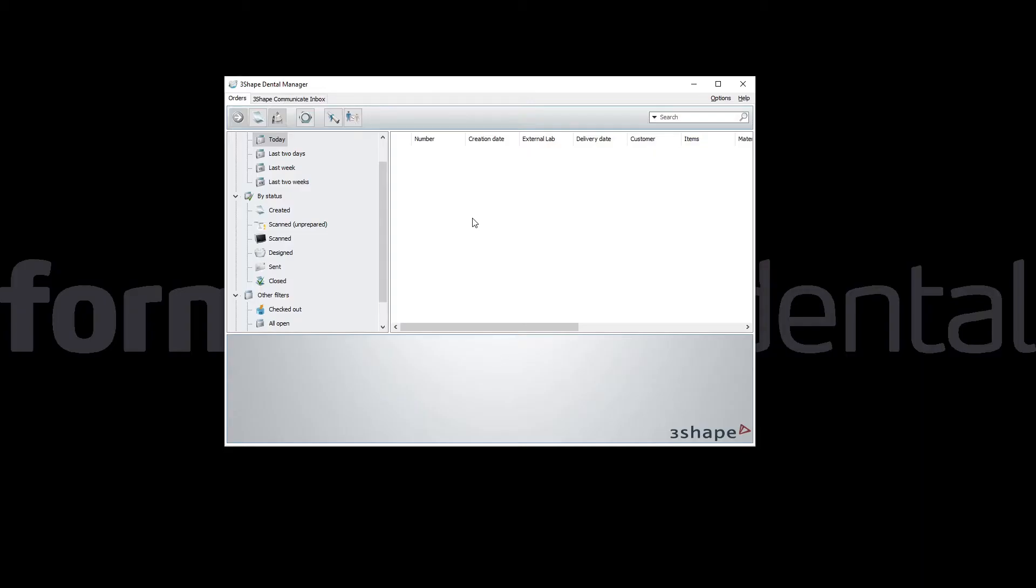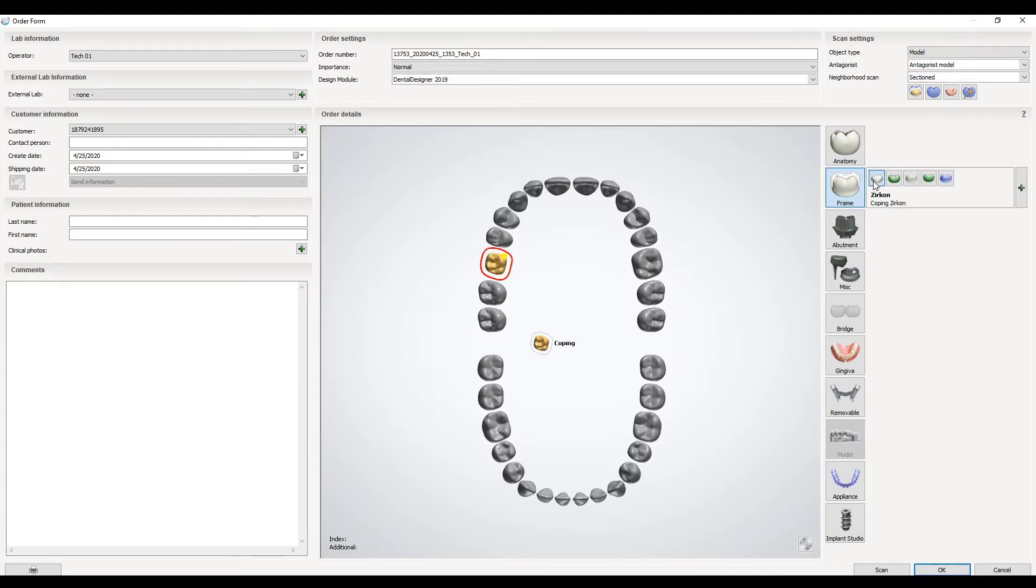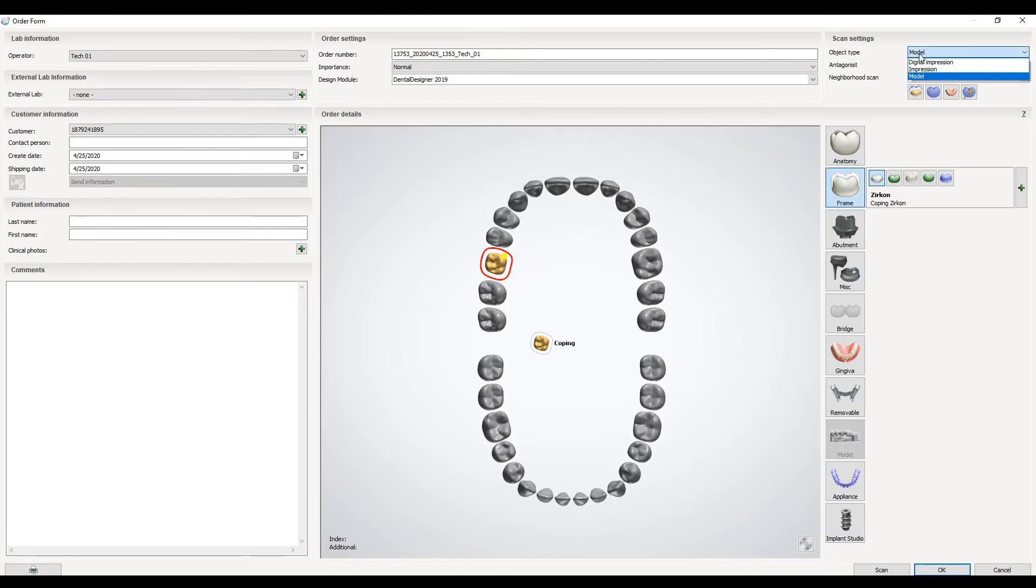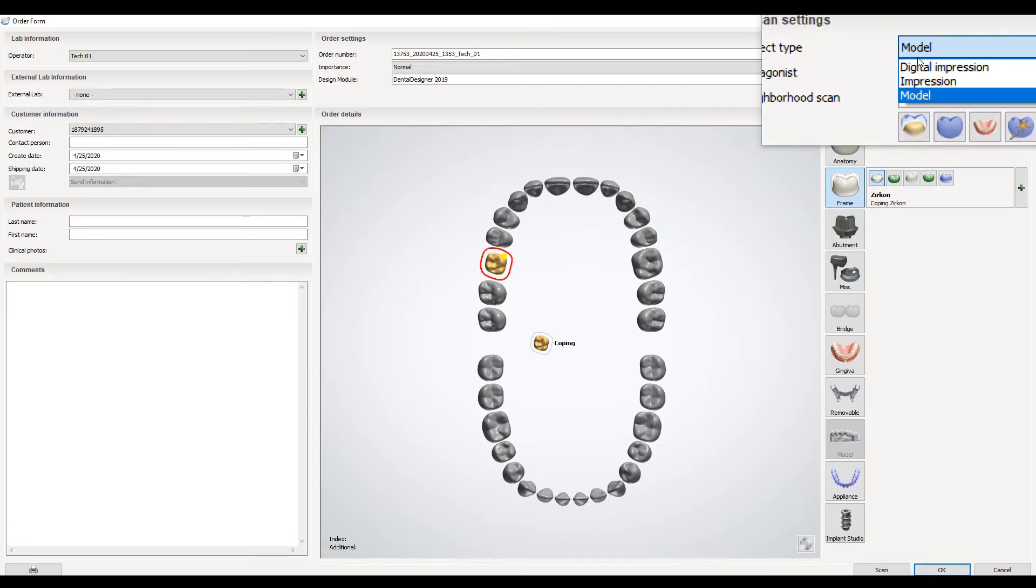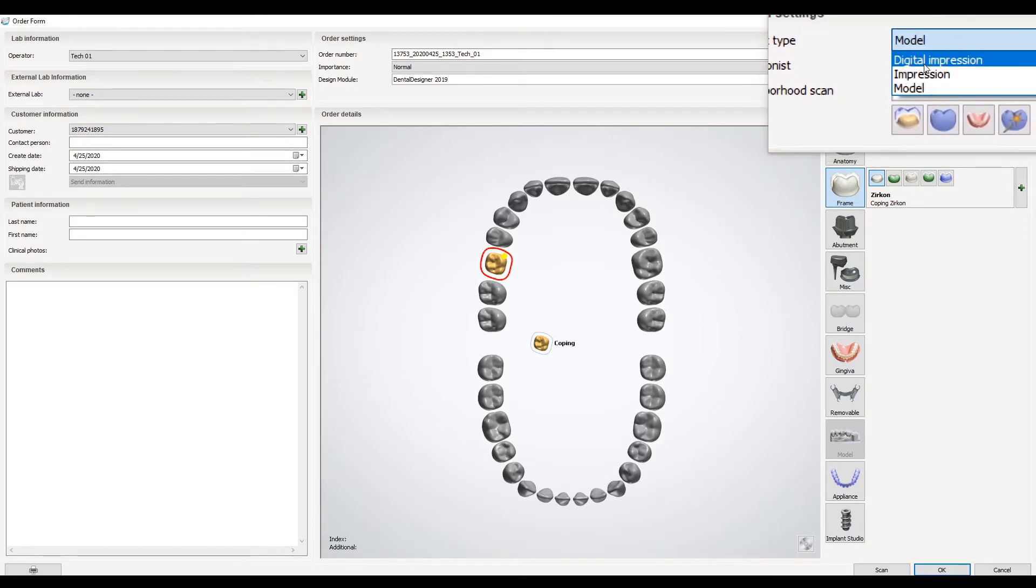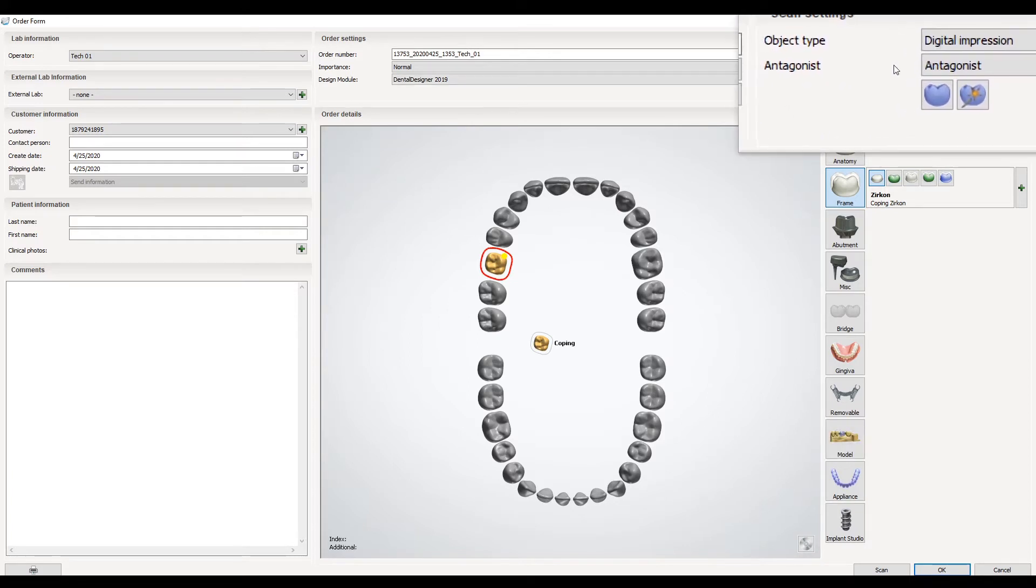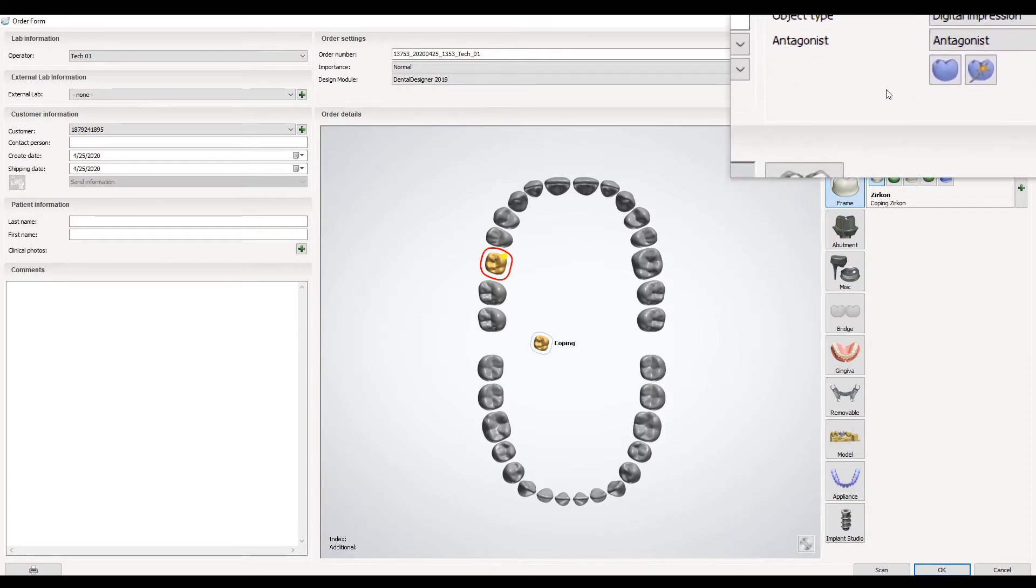You have your 3shape dental manager open here. To set up the case, you create a new order like normal and select your restorations like normal. On this one I'm just going to do a simple coping. For building models it's typically done with digital impressions, so on the top right here I am selecting digital impression. This could also work for impression scanning workflows, but this will be highlighting digital impression.